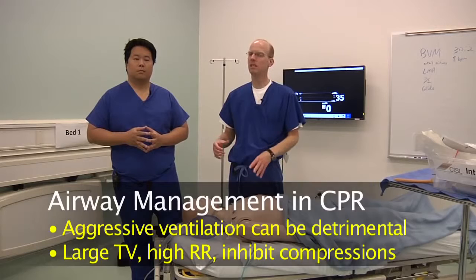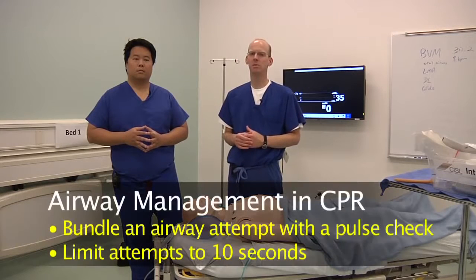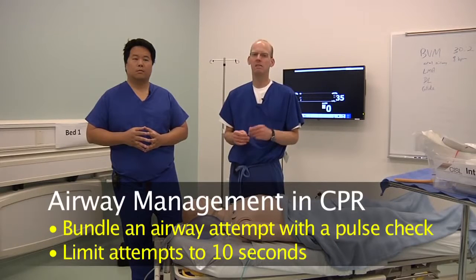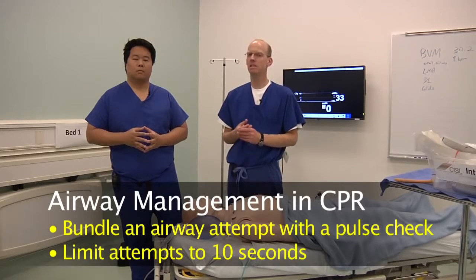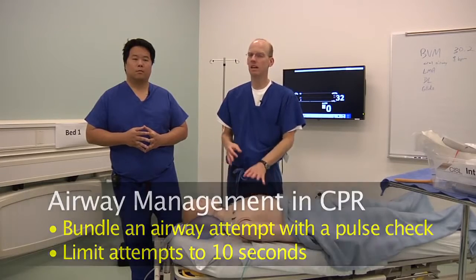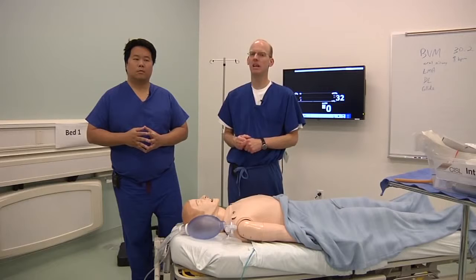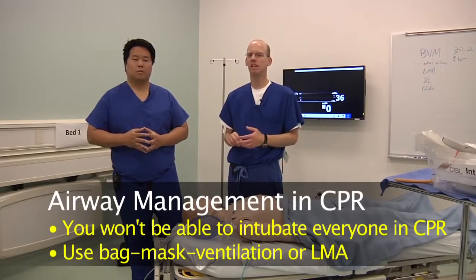Do what you can. We do have some techniques that we can quickly show you on how you can improve things. You can try and bundle a direct laryngoscopy with a pulse check, but like I said, we want anything that's not a compressing event to be less than 10 seconds. It's actually pretty hard to intubate someone in less than 10 seconds. And then they've got to start. They can't wait for you. They've got to start compressions again as soon as they can. So get away from this idea that you're going to intubate everyone in an arrest. Just figure out how to effectively ventilate the patient.